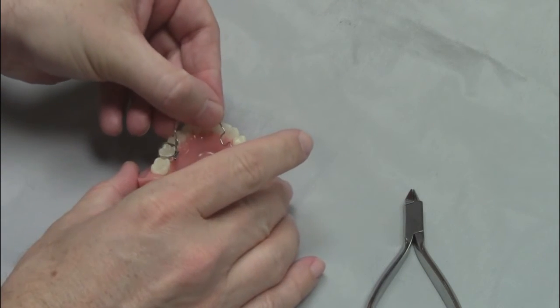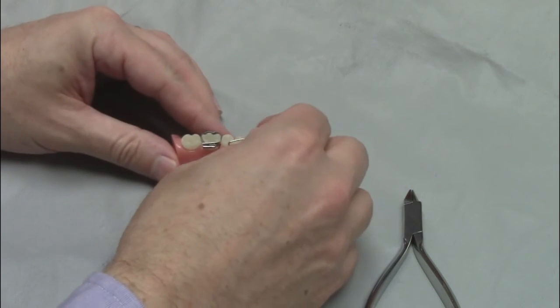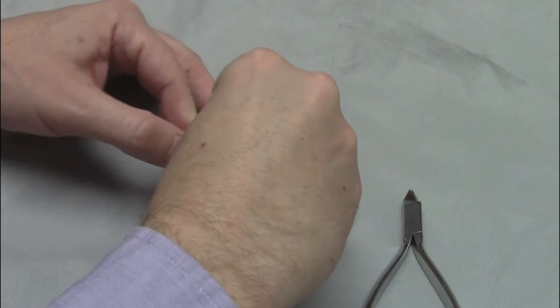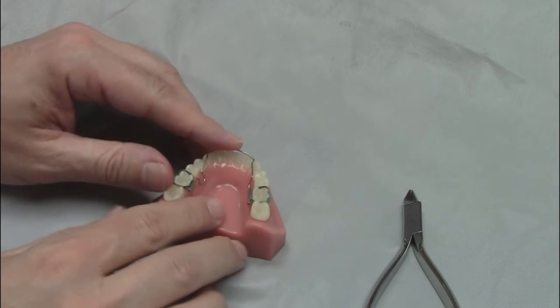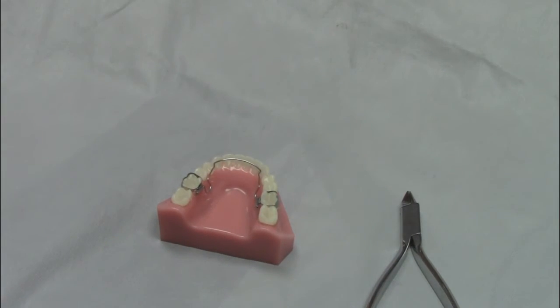Once you have activated the appliance, insert it back into the tubes on the molar bands. As you activate the wire, make sure it does not come in contact with the soft tissue. This is a light wire appliance, but it will create a large amount of force. Don't over-activate the appliance — you'll want to err on the side of doing too little activation instead of over-activating it.